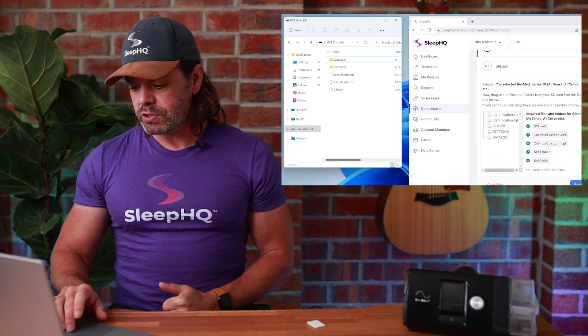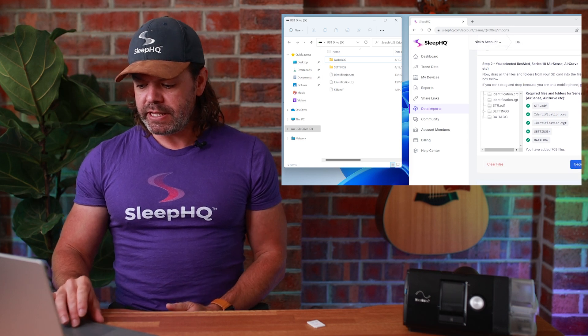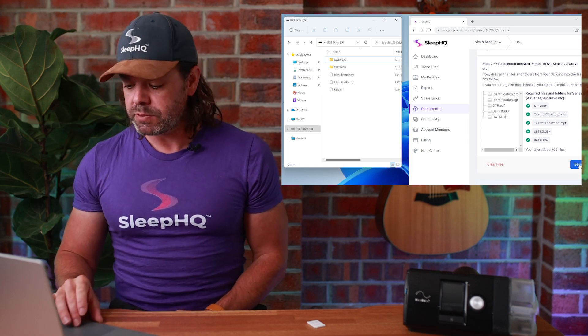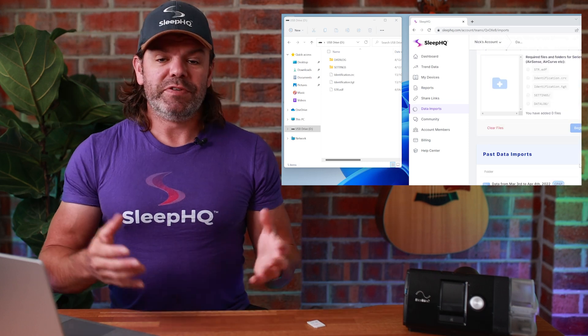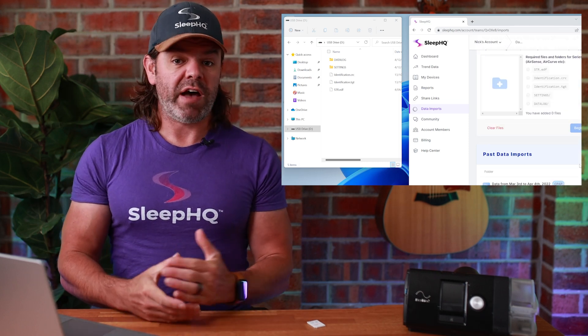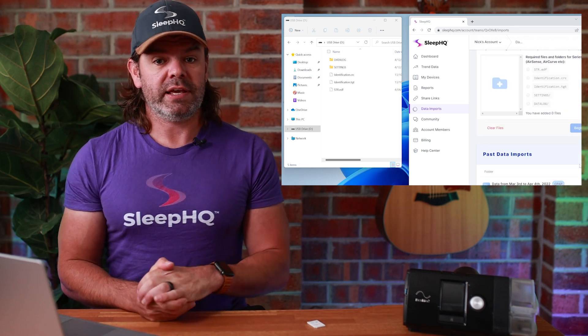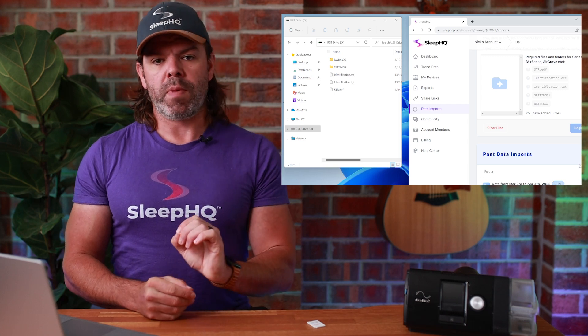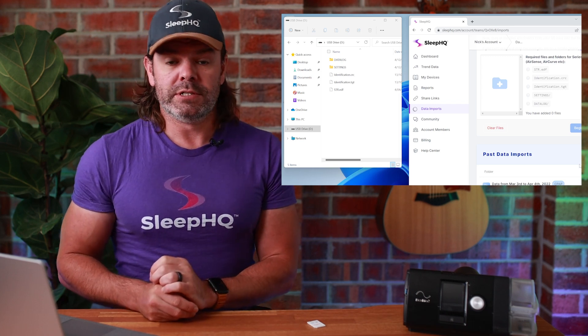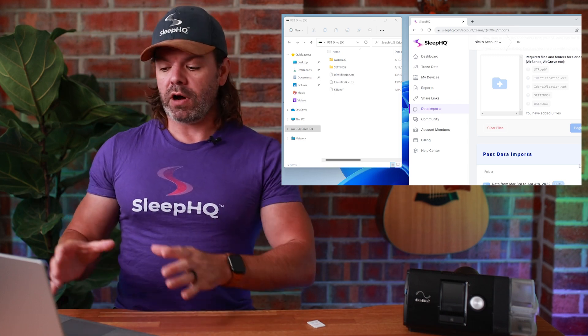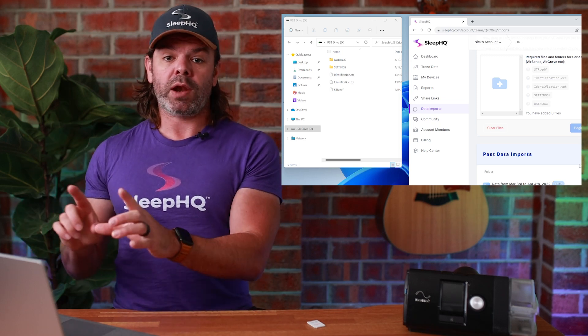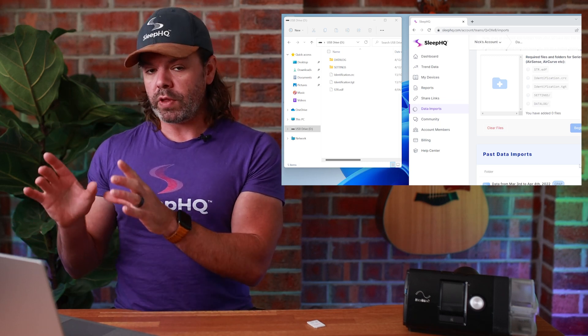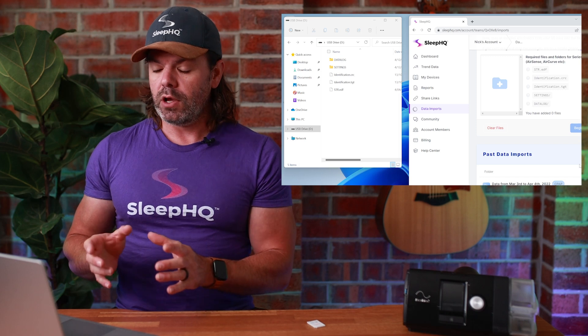Now we'll just scroll down a little bit. You can see here it's got a nice big blue button that says begin upload. I'll click begin upload. Now if it's your first time doing an upload, there's a good chance you have a lot of data on that SD card. So your first upload might take quite a while. So just go and make a cup of tea, hang tight, make sure you stay on this page. Don't navigate away from the page until that upload is complete.